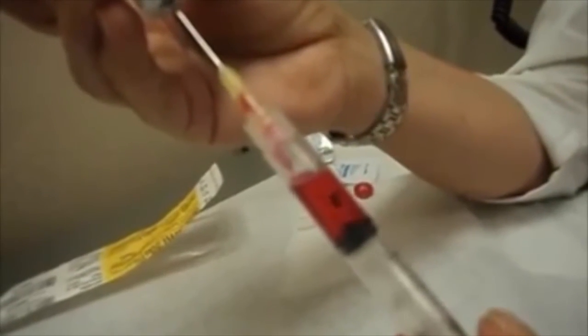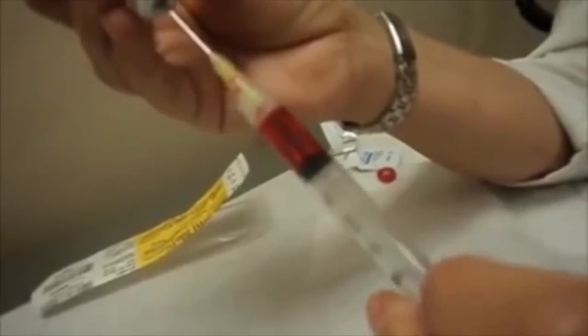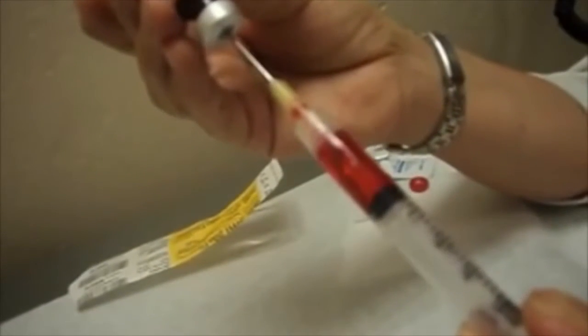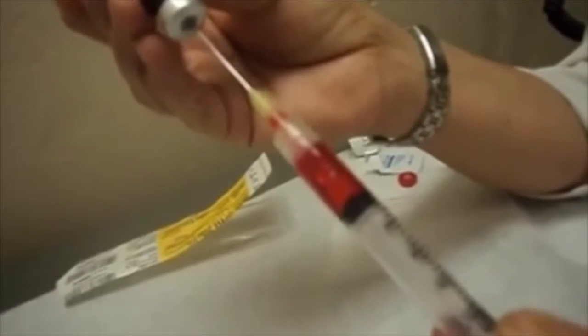So what I'm doing is filling up the syringe. While you're doing that, you can push the air back to the vial and see that you have the proper amount. So it takes very little to get to the 1. It's also okay to overfill a little bit and then push back what you need.